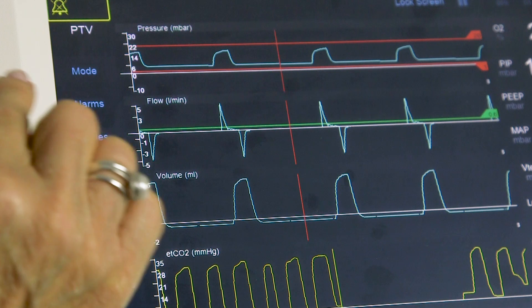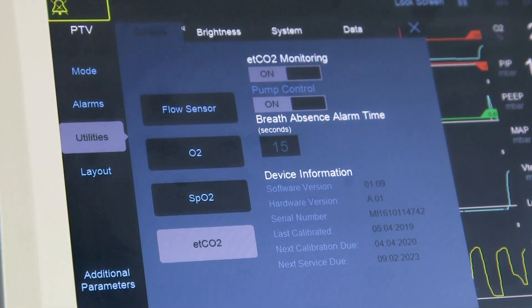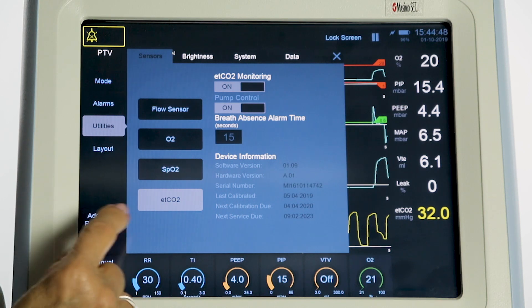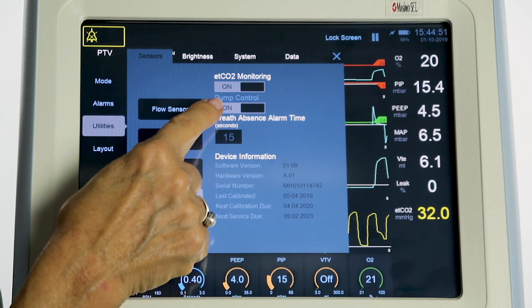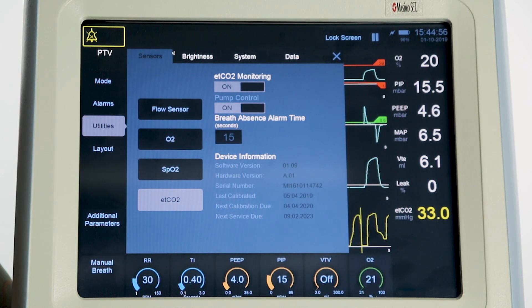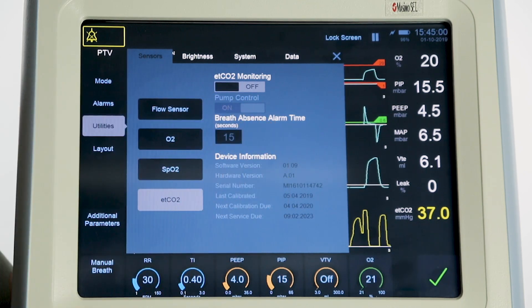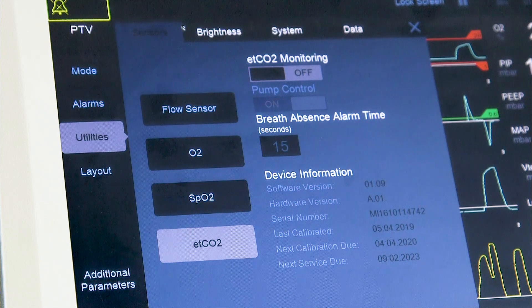Configuration of the ETCO2 module is made by accessing the utilities menu. This menu enables the user to turn the module and module pump on or off. If you turn the module or the pump off, monitoring and trend data storage are suspended. The user can also set the time trigger for the system.